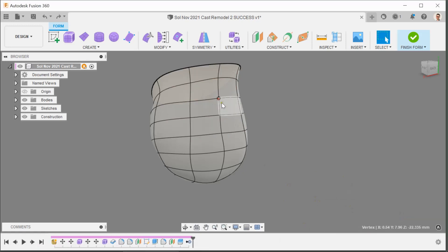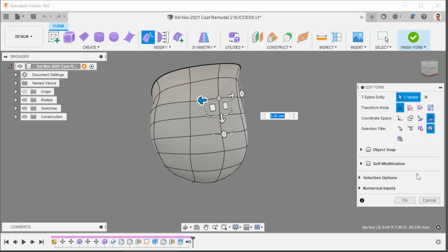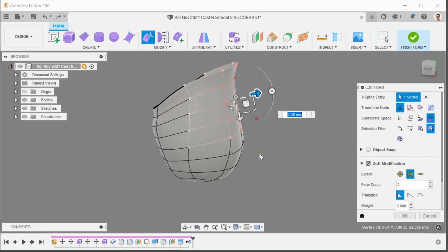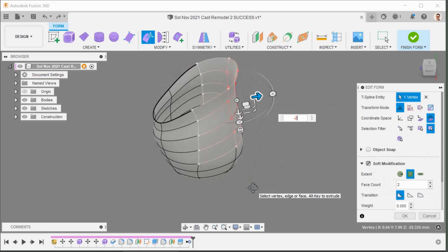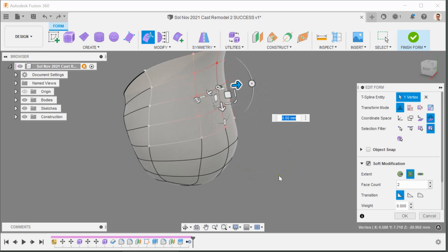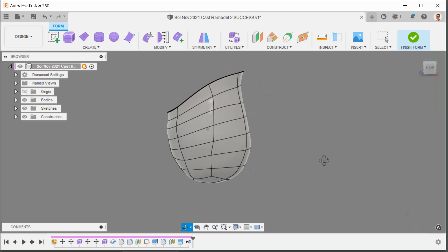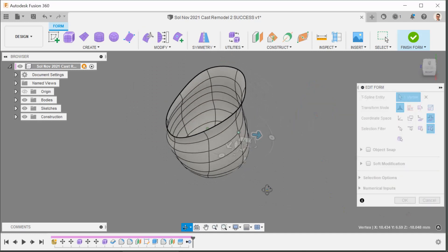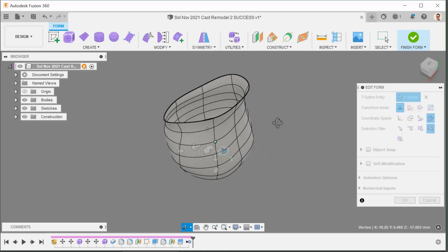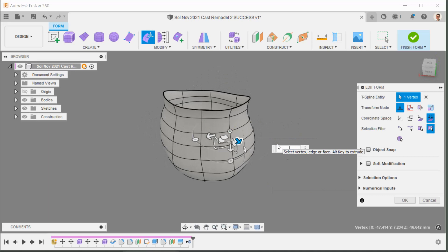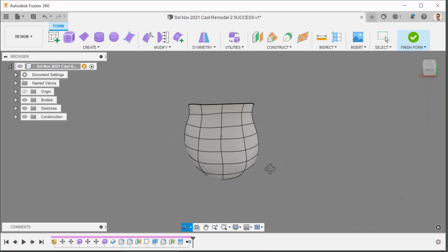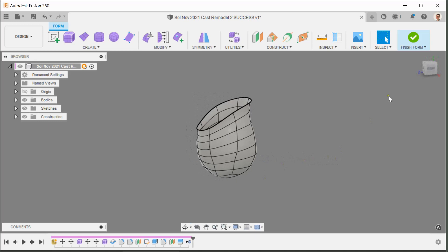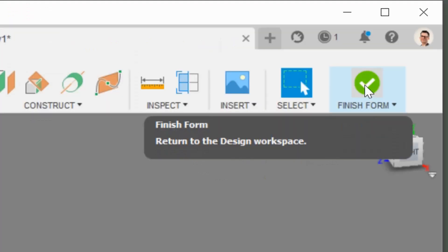I click OK, select the point again, go through the whole process with Soft Modification on, and enter minus 2 millimeters. Then I'm also going to change the second point — minus 1 millimeter.